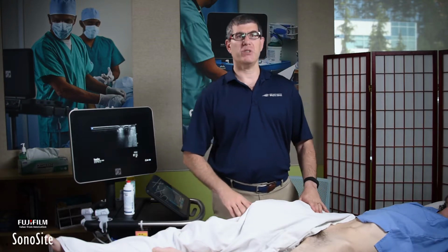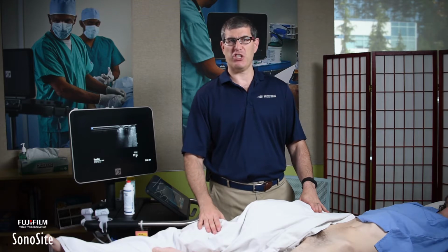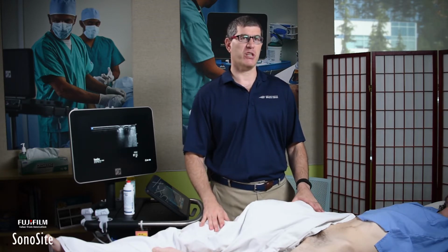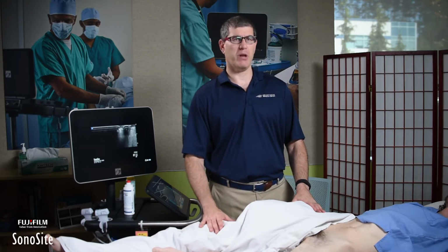One of the important things is that before you do this examination, have a conversation with the patient about discretion so they know that there's a reasonable likelihood that they may have exposure of their genitalia during the examination, but you want to make sure you do an appropriately thorough examination.